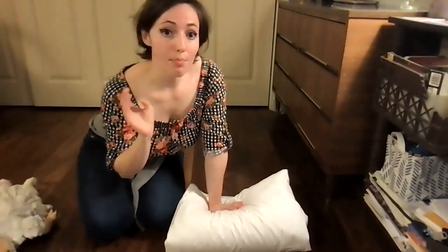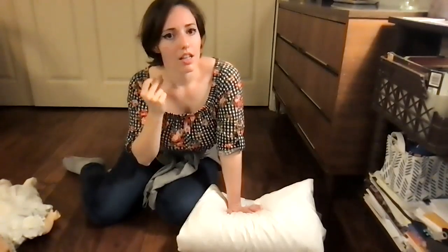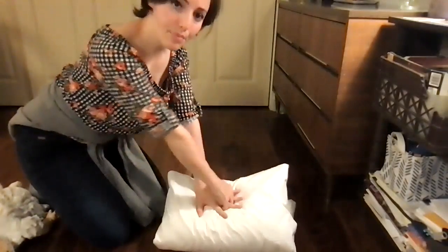You're doing this at a rate of 100 to 120 beats per minute. That's songs like Staying Alive by the Bee Gees. Staying alive, staying alive. Like this beat. That's how fast you want to be doing it, maybe around 100 beats per minute. So that's the speed you're doing your compressions at.